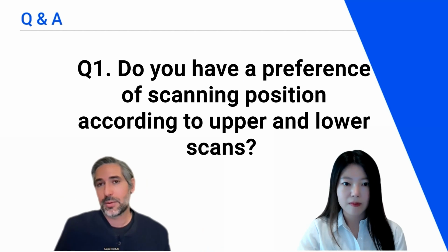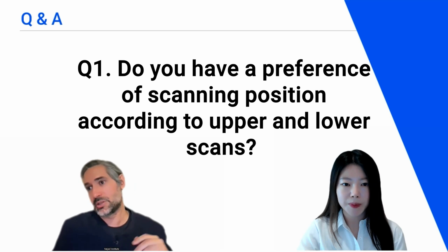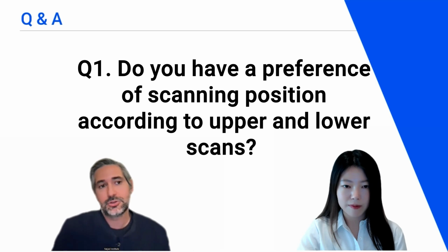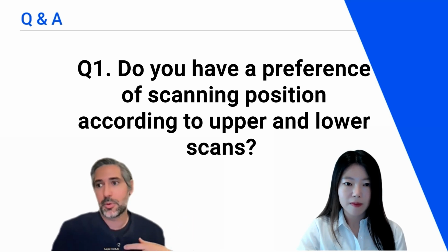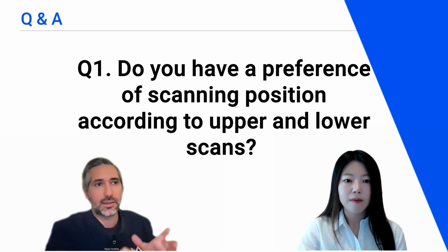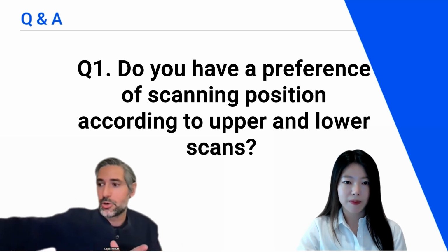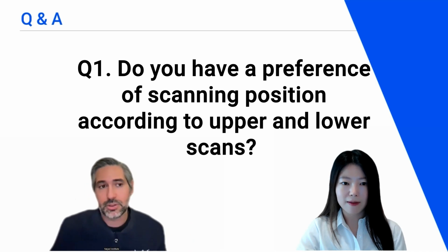them. And then I go to 12 o'clock sometimes when I'm dealing with, let's see, top left. If the patient turns their head and I sit at 12 o'clock, I can look right down at the area I'm scanning. So 9 to 12 is my preference with the monitor behind me. I actually tried a couple of times to scan with the monitor in front of me, but I found it more natural to be looking at the patient's head and the monitor in a more straight trajectory, as opposed to the monitor on this side and the patient's head on this side. So it works out really nicely.